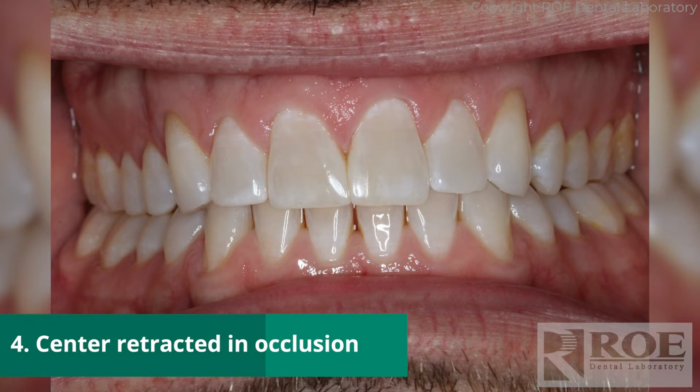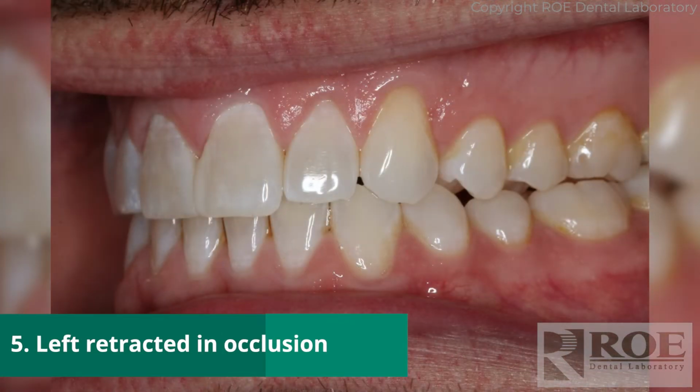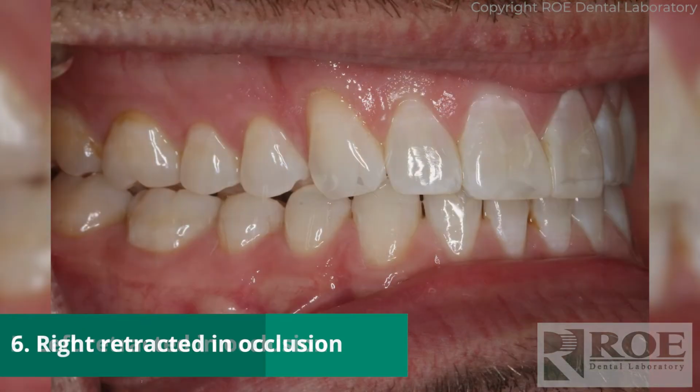One is the retraction isn't pulled back enough. The other is we don't get a nice picture that's at about a 45. We get too many that are aimed straight on. Really like to have a nice picture from the labial, from the buccal side. But also, we like to have photos of just the anterior with the teeth together. Often we get numerous pictures of occlusal photographs, intraoral photographs, smile photographs of patients out of occlusion. We really don't need any of those photographs. This is just to check articulation.